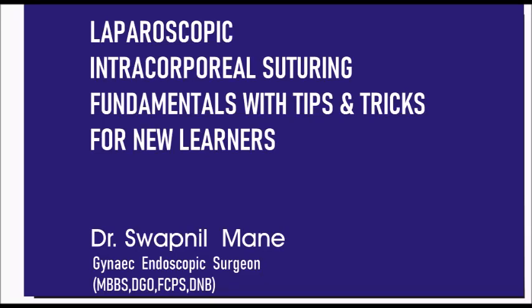Hello everyone, this is Dr. Swapnil Mane. Today I am going to discuss a very important topic: laparoscopic intracorporeal suturing fundamentals with tips and tricks for the new learners.